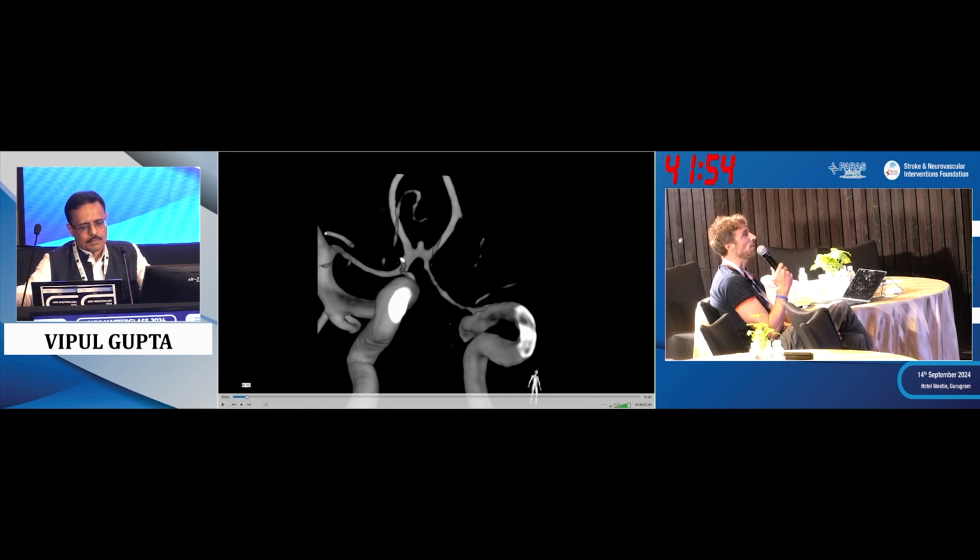So I think what you did is very good. And what is interesting is that it allows you to accept to have a coil in the artery. So that I think is very smart, because you are not under the obligation to finish the coil, where it's the last loop that is perforating the aneurysm. The last push, when the pusher arrives and the coil is a little bit more straight than the first loops that are very soft. So that's extremely good. I think the way you did it.